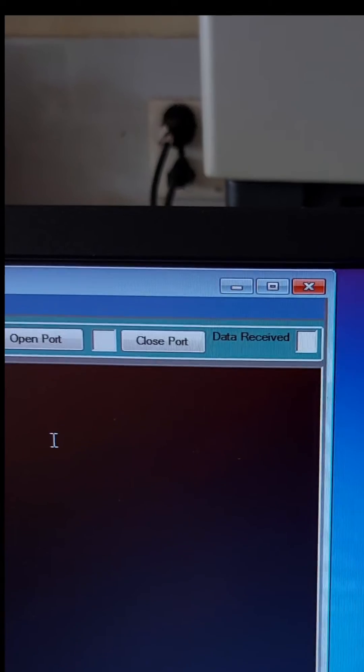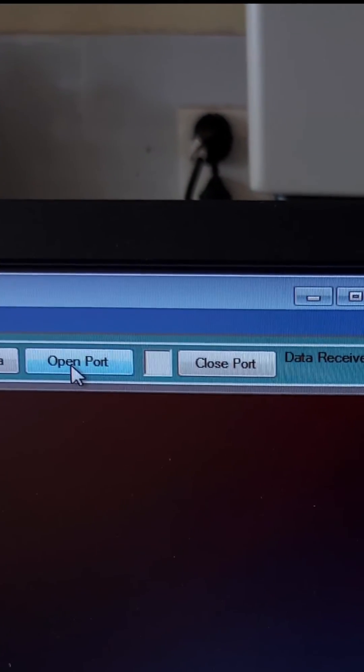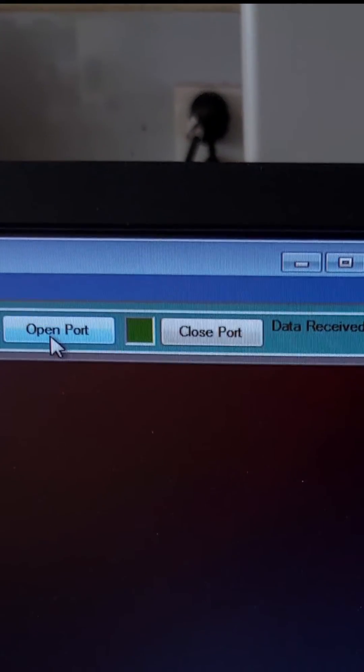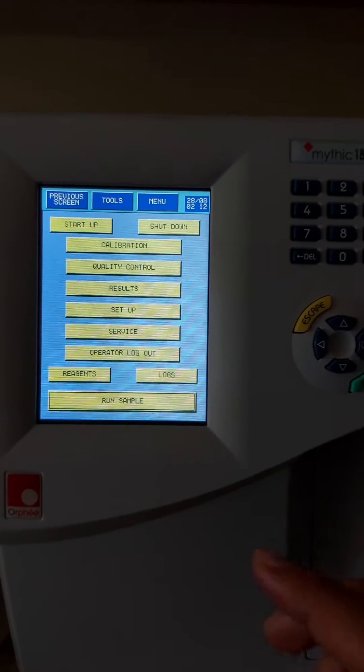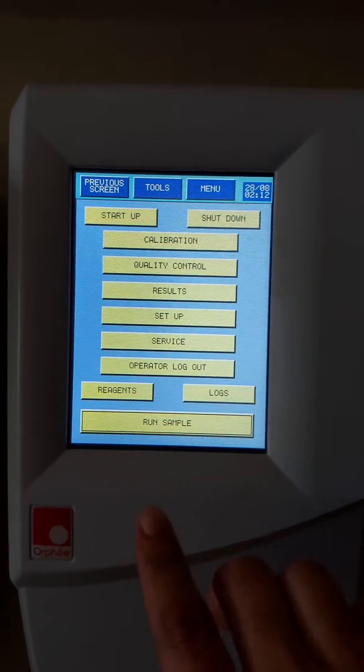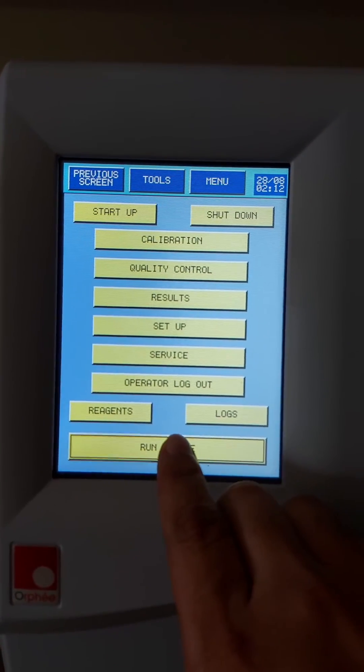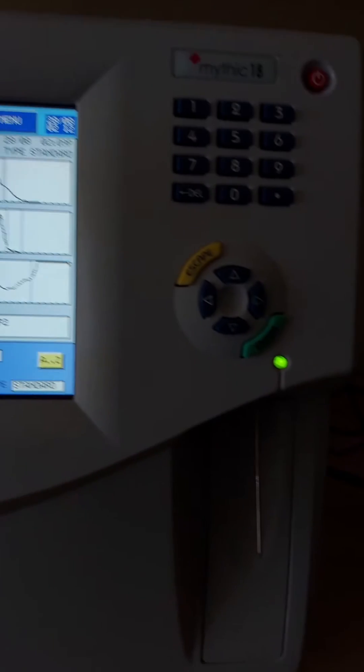Now we will press the open port button and make sure the green signal is on. When our sample is ready for analysis, we will hit the run sample button.